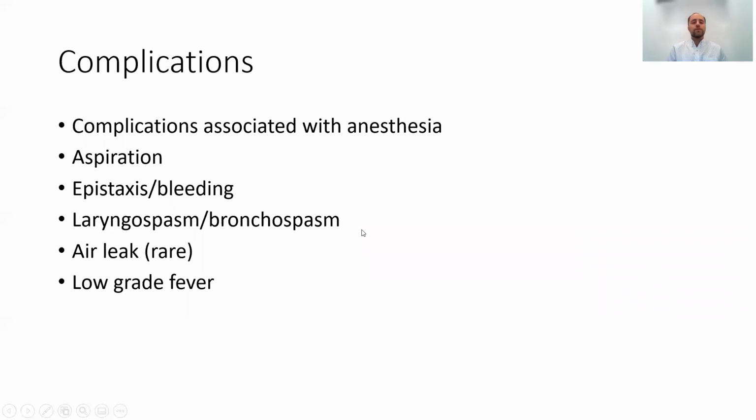Complications of a bronchoscopy include those associated with the anesthesia itself, aspiration, epistaxis or bleeding, which is generally quite mild, laryngo or bronchospasm, which are usually the most common complications, and that's why we instill lidocaine. Air leak, very rare, and low-grade fever, actually quite common. In fact, I tell all patients that they should be taking Tylenol for 24 hours after the procedure because of a low-grade fever.